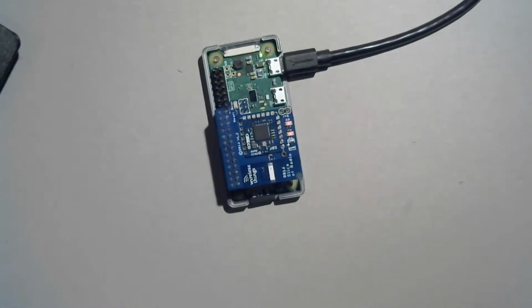So you can see really the only things that are supported right now are getting the current CGM page, which is just an integer. It's a moving integer. Every time that we wrap over to a new page of data, then that number increments by 1, and that's how we know which one to fetch. Read CGM page actually pulls in 1,024 bytes of data, reconstitutes that into meaningful information, and then gives us back a list of CGM points, either sensor readings or other events that happened in the CGM history.